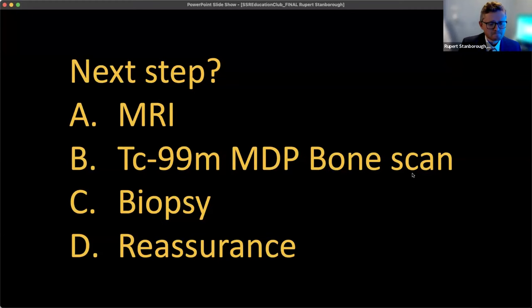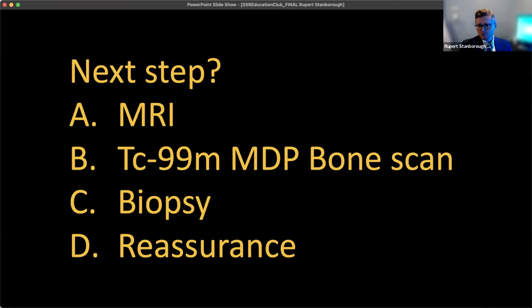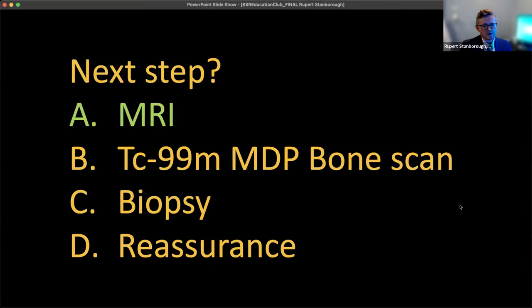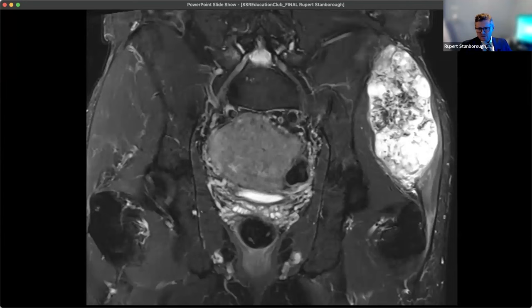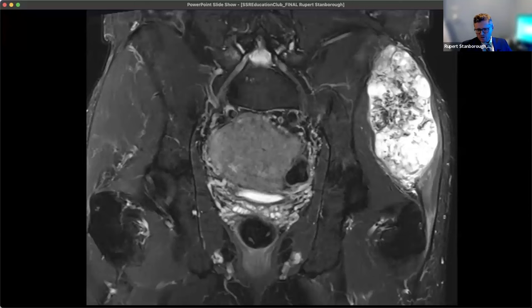So what's our next step? Is it A, MRI? B, a Technetium-99 bone scan? C, just go ahead and biopsy it? Or D, reassure the patient that it's nothing to worry about? MRI is the next step. Here is the coronal T2 STIR of the pelvis, corresponding with that mass in that left upper buttock. I want you to think about the signal intensity and see if that narrows down any of your differential, and think back to the radiographs and the matrix you saw.